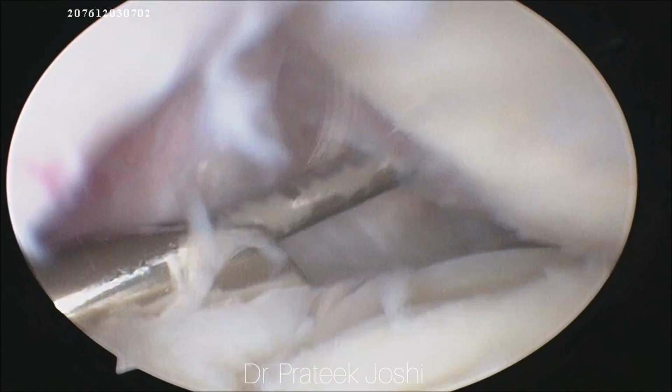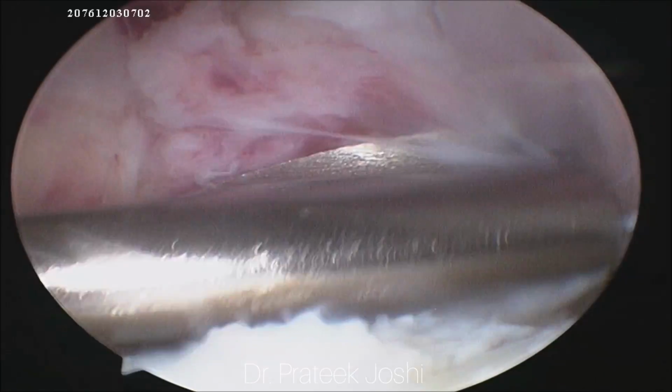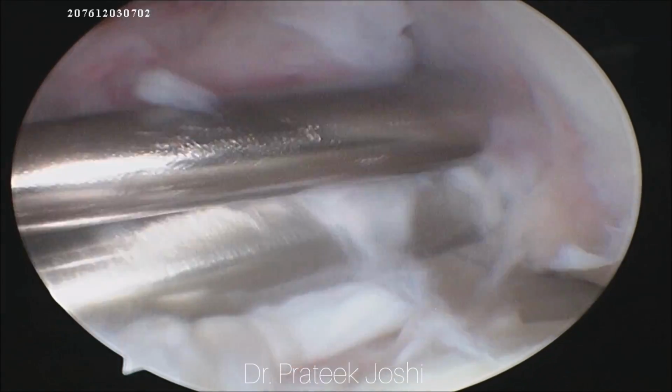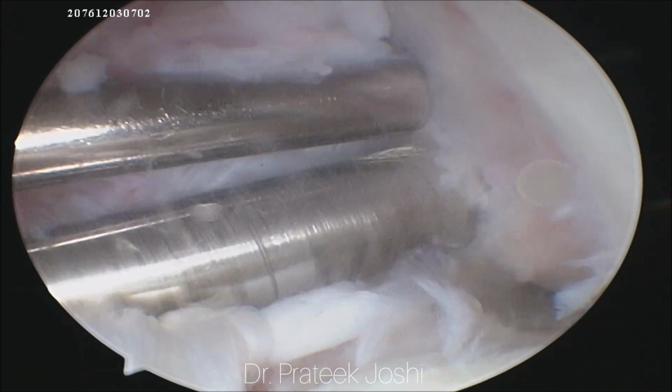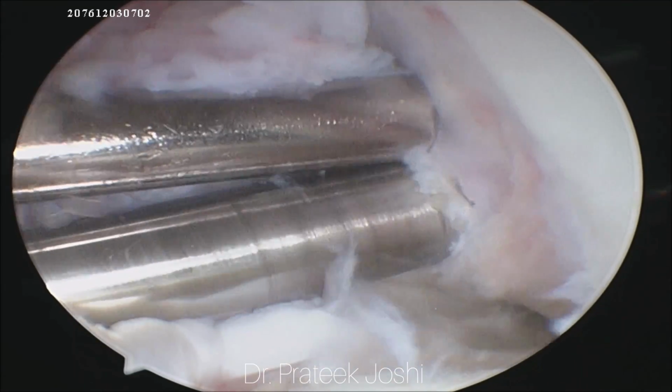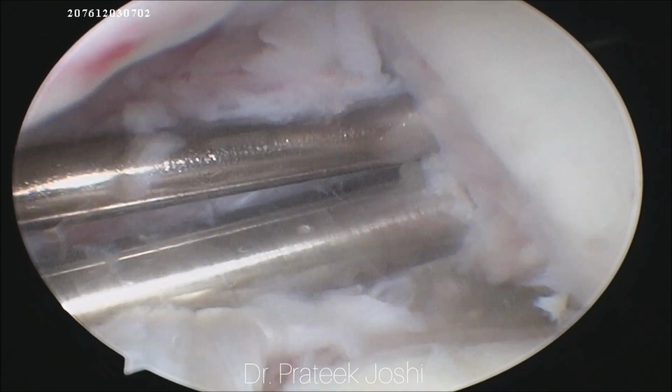So the guide wire has been drilled through the ACL footprint on the lateral femoral condyle, over which I am going to drill with an endobutton drill bit, and in this case it appears the depth of our femoral tunnel is going to be around 30 to 35 millimeter.